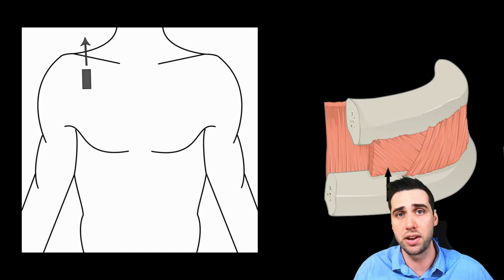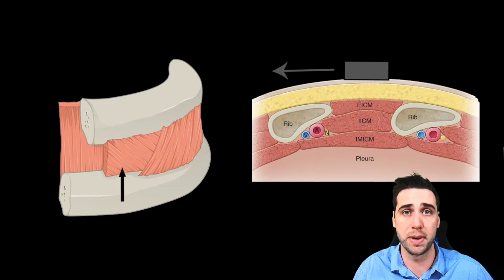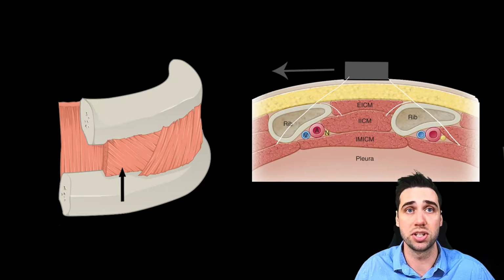So when you start out, you're going to put the probe just below the patient's clavicle with the indicator pointed towards the patient's head. The orientation on the rib is going to be like this. From the ultrasound's perspective, what you're going to see is ultrasound beams coming down here. Ribs are going to just basically be shadow for you, because the ultrasound doesn't travel well through the ribs. They're so dense. So you're just going to see black shadowing behind them, just like this.